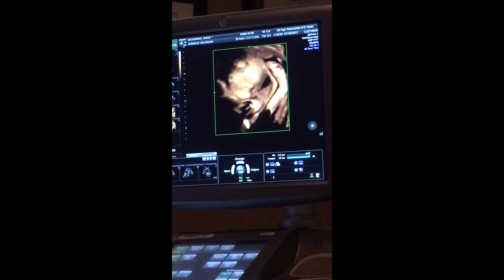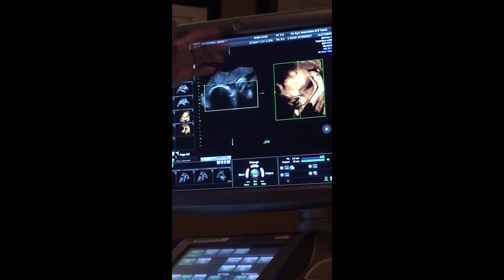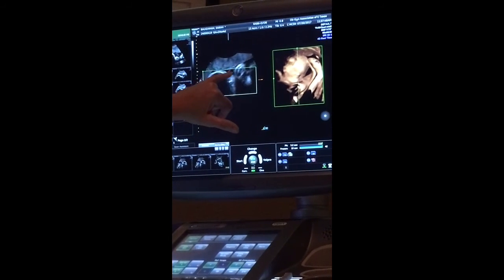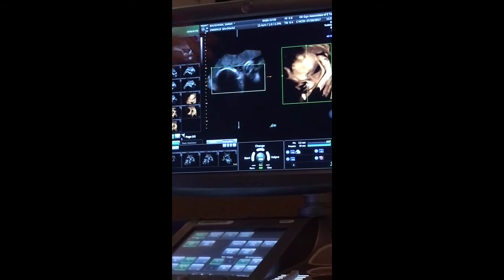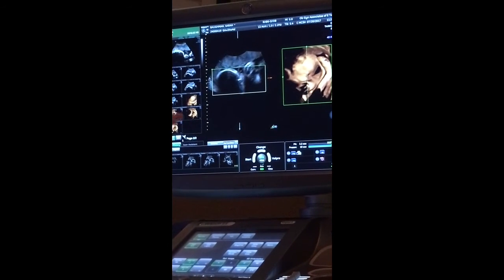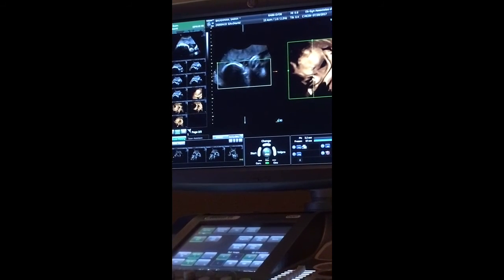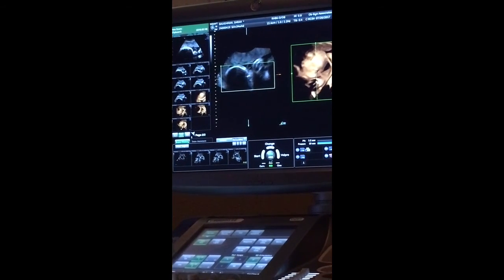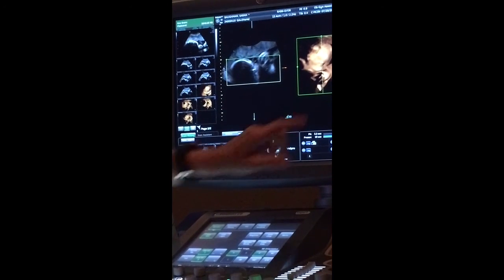And this kind of looks weird right here, and let me tell you why. The way 3D and 4D works, this is 4D, but if you look at a frozen picture, you really can't tell the difference. Everything behind this line, you can see like skin level. Most people think of 3D and 4D as just a pretty picture, and of course it is. But there are some instances we use it in diagnostic cases, like looking at bone inside. So this is the skin line of her arm, because part of that elbow is outside of that focal zone. So you can see both bones, there's two bones in your arm, and you see both of them.